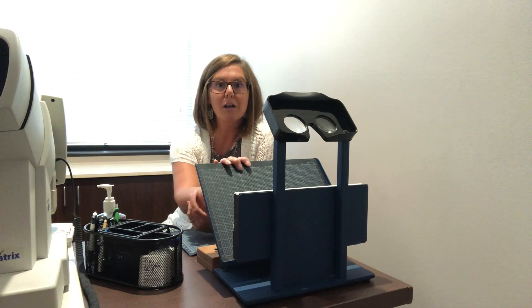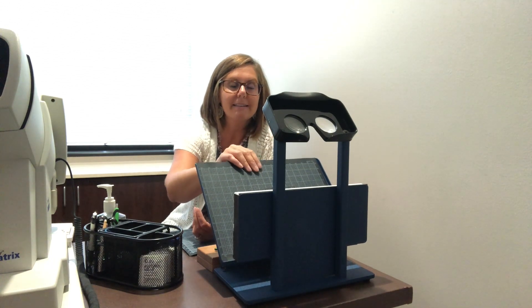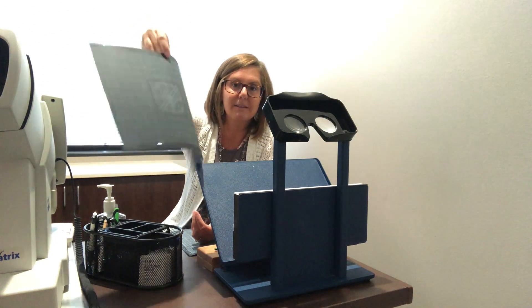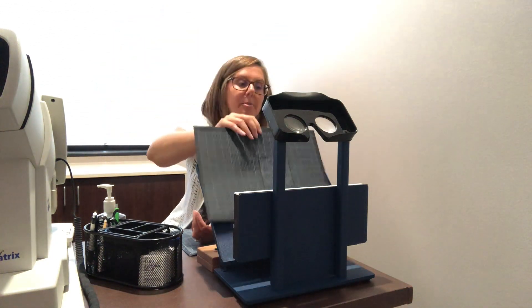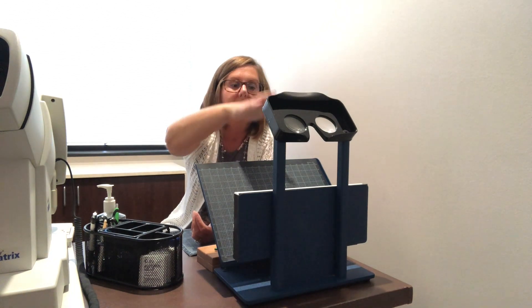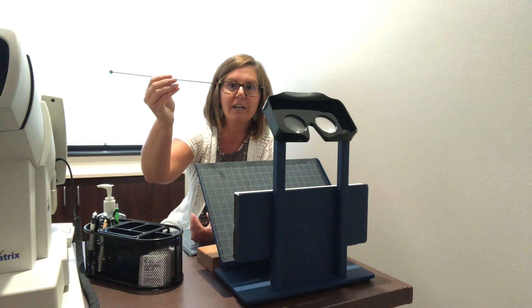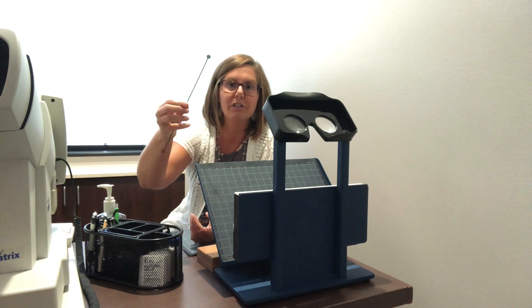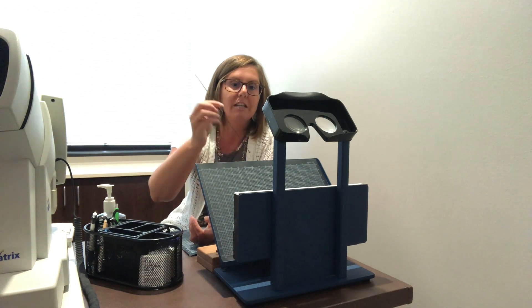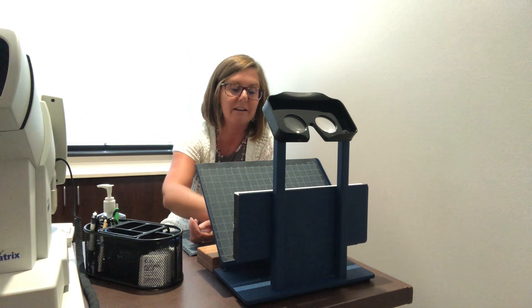Now let's talk about this particular test. This is what the test paper looks like. The patient would sit here, lean down into this machine, and we would show them a target. I'll show you a large target — here's red. We have different colors that we use with them.